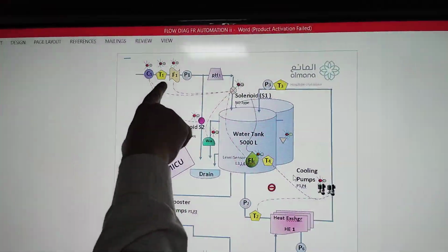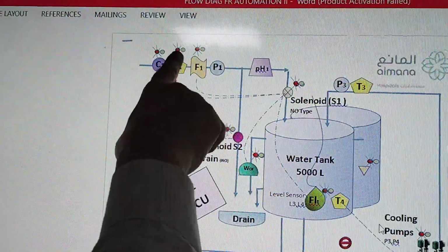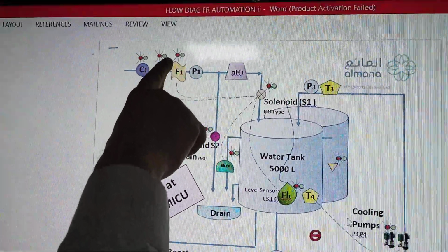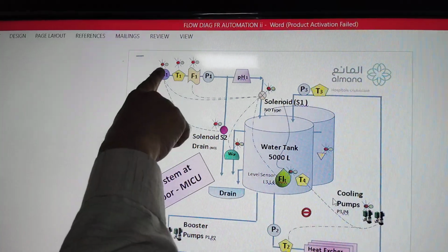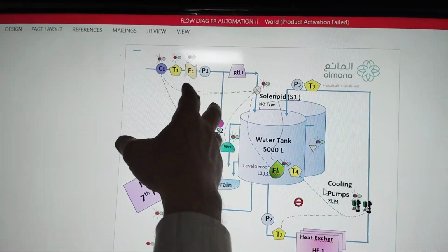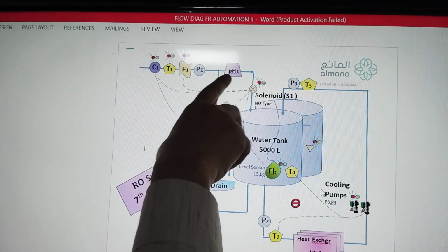So next is the temperature. It will monitor the temperature. If the temperature is very high, it will give an audible and visual alarm. Here also, audible and visual alarm. If the problem is severe, then it will give an audible alarm. If the problem is not severe, it will not give one.